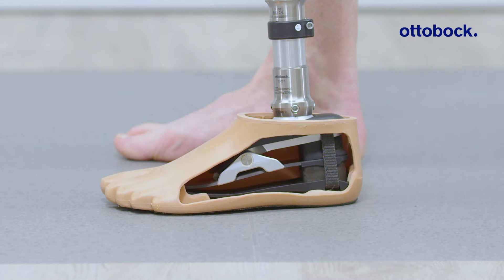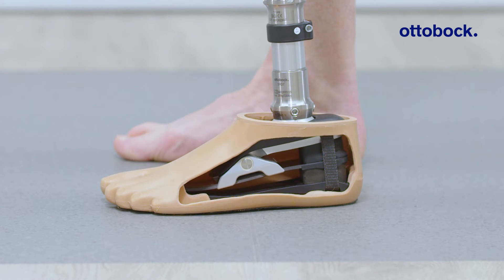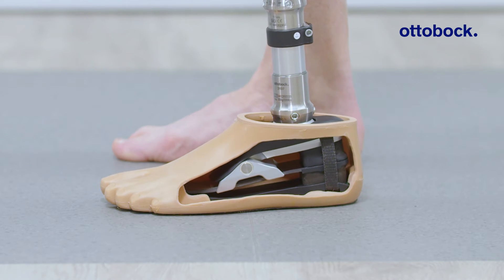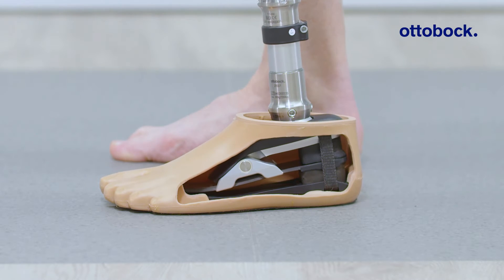Notice how Evanto is connected structurally at three points: the heel, mid spring, and the toe. These three connections enable a three-point loading of the carbon fiber spring, which results in the most efficient energy storage and return of a foot with such a low build height.